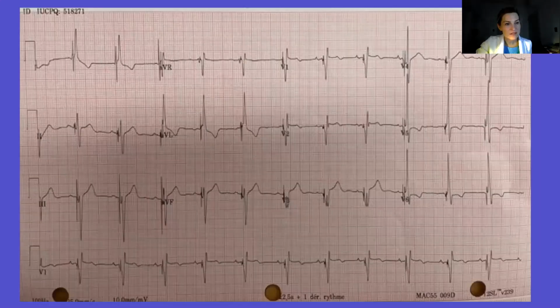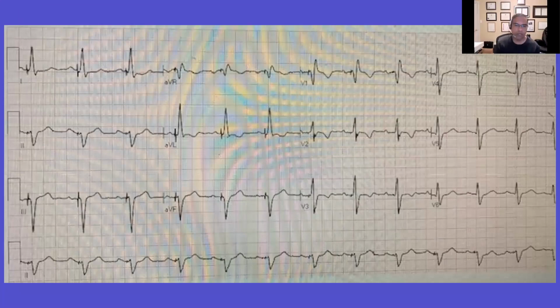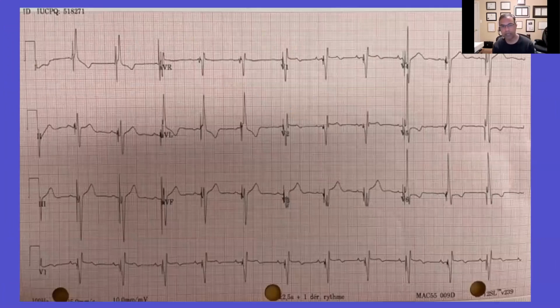Here's his next one. It's a different patient. And then this is his other one. There's a little bit more slurring here. I guess in the next session we could look at these ECGs with him. Yeah, go back one, just out of curiosity. Here it's interesting because I don't see very much latency at all.